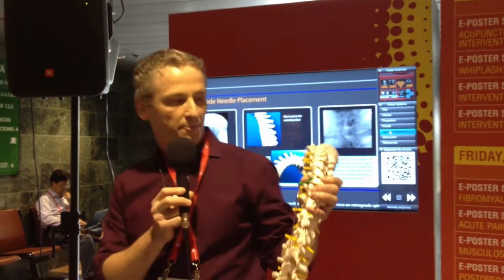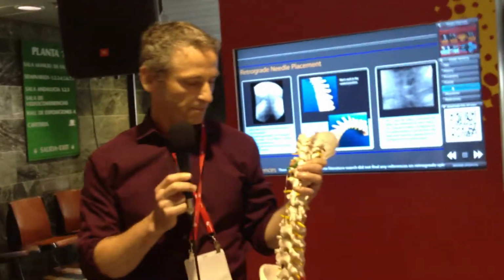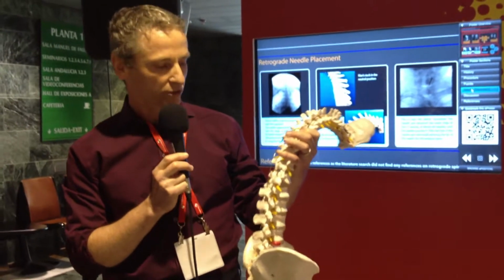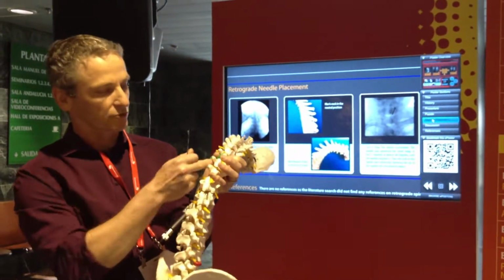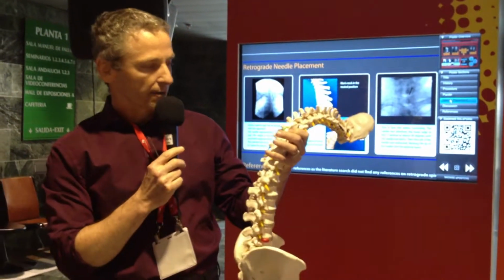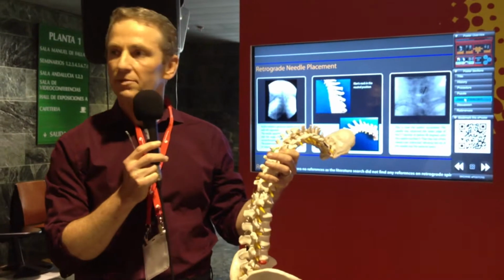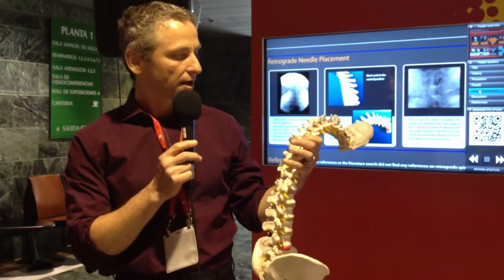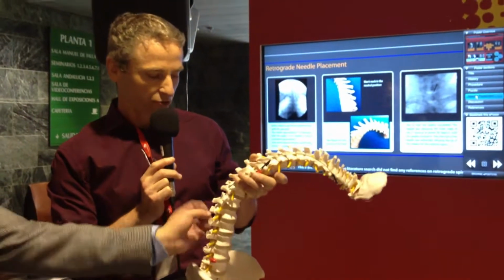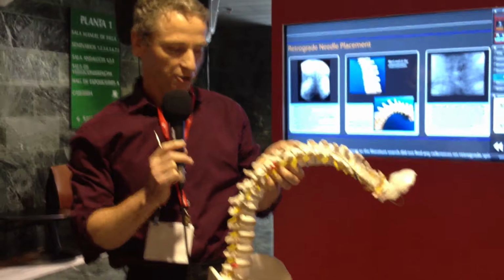I wanted to introduce Sam from the anatomy lab. He will help us to demonstrate the problem. When a spinal cord stimulator is placed traditionally, it is placed from the lower back up. Now imagine if Sam woke up after anesthesia and then got up from our table, he would bend back to tie his shoelaces, and he's going to bend his back.